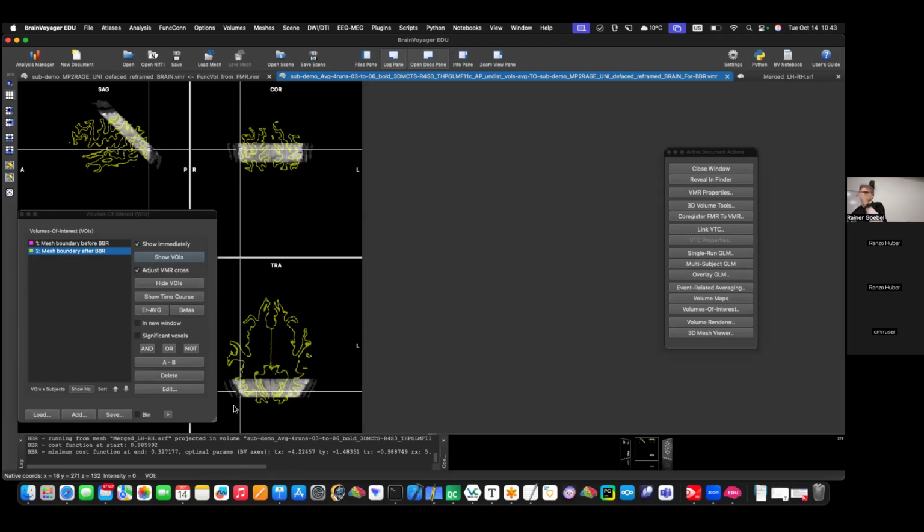So this is so good that you not necessarily need ARMS. I think it's not needed because you see the, Federico, see this? It follows here the boundary pretty nicely. You know what, he used the distortion corrector? I did. Yeah.